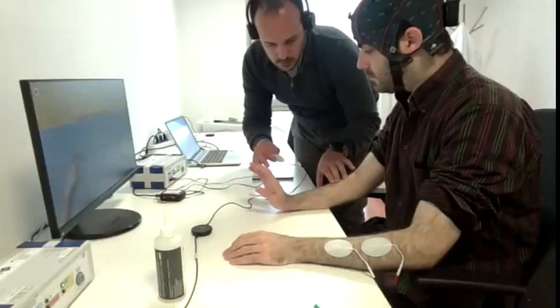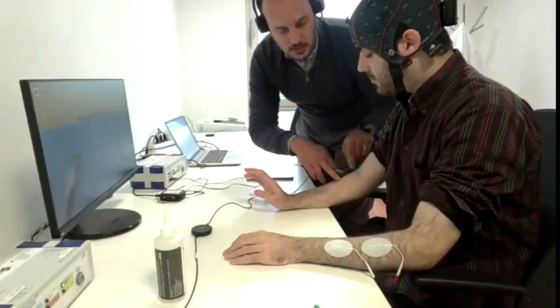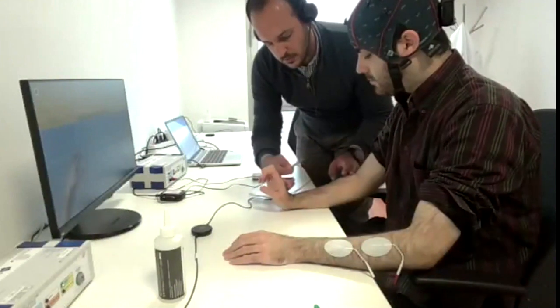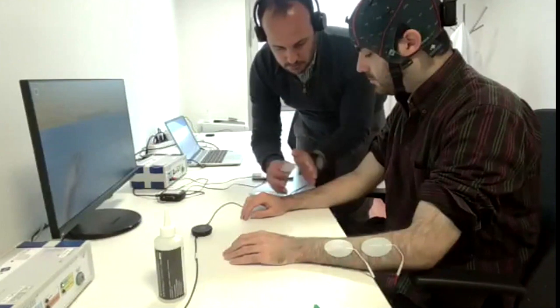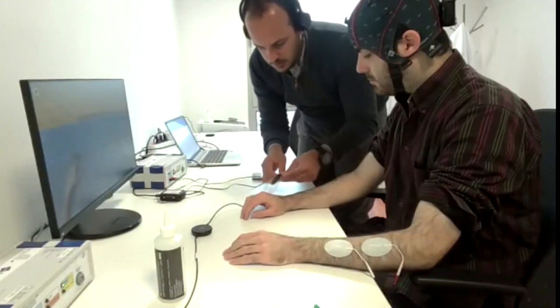Can you please raise your hand? Okay, exactly. So we can notice clearly that here is the muscle belly. The muscle belly is in general over this side. So I don't recommend putting the electrodes below that point because this can be painful, as I said before.